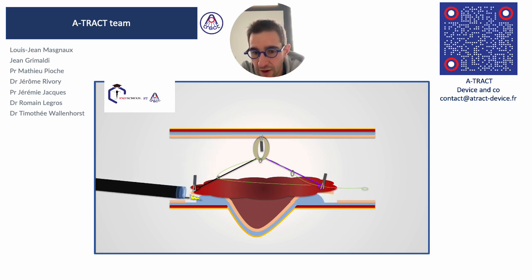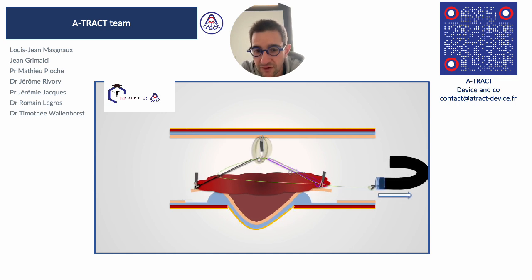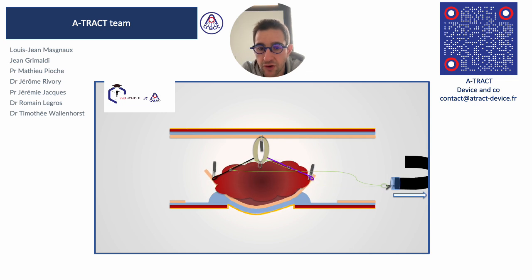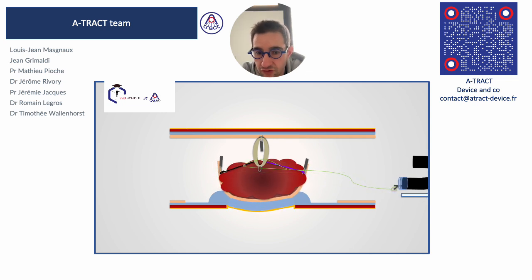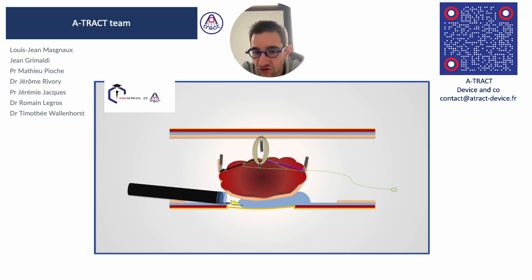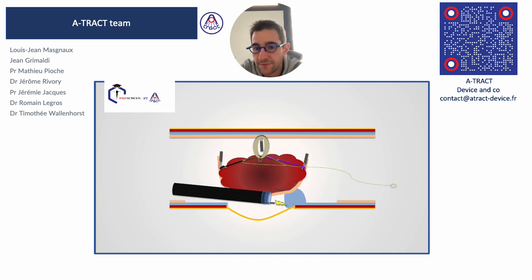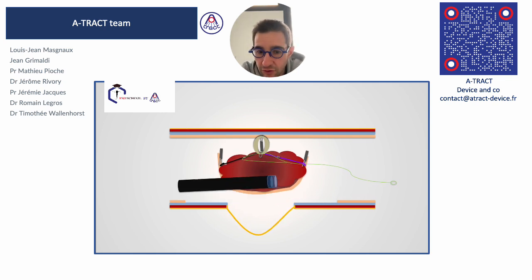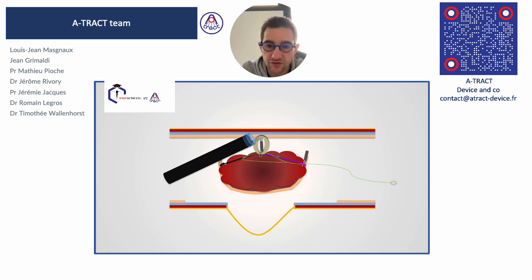And finally, when the force of traction is concentrated in the center of the diverticula, it is easier to be tangential to the deepest part and complete the ESD resection to have this R0 resection of a high-grade dysplasia adenoma without positive margin, and therefore this patient is cured and will have his next colonoscopy in 3 years.